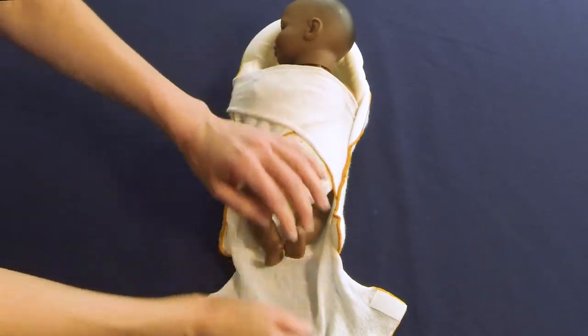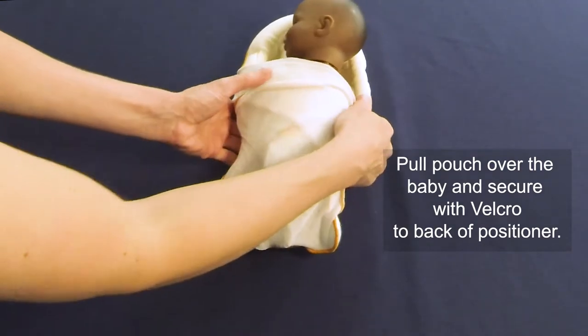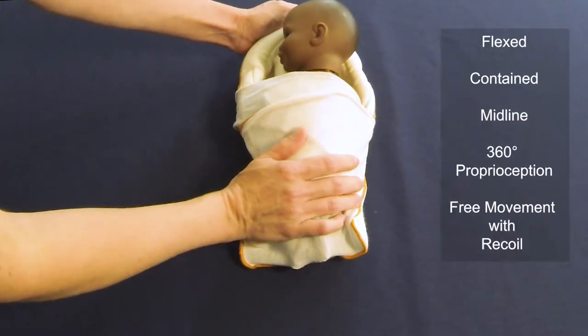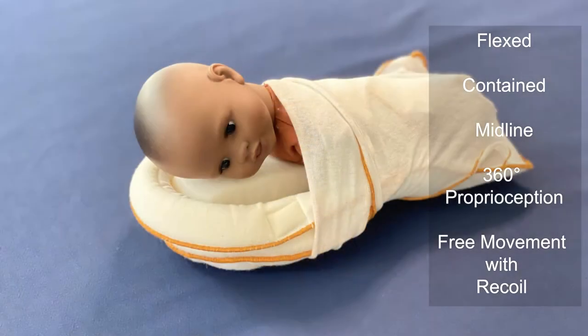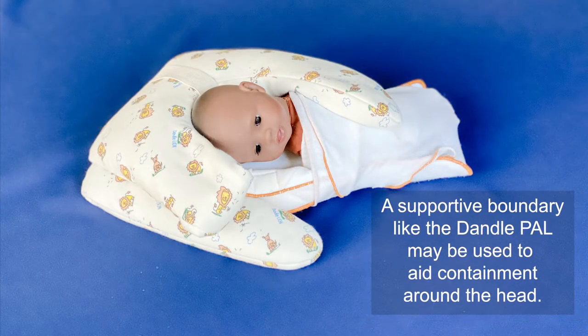Wrap the longer wing over the shorter wing and attach with Velcro to the back of the positioner. Keeping the baby's legs flexed, pull up the pouch around the baby and attach to the wings and the back. If desired, an accessory like the Dandel Pal can be used to provide additional containment around the head.